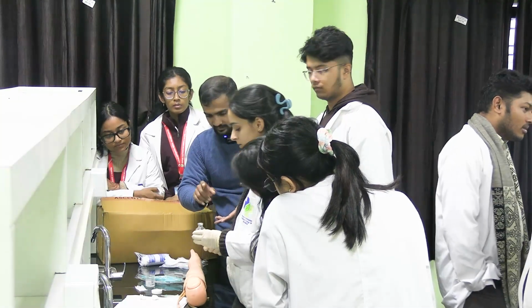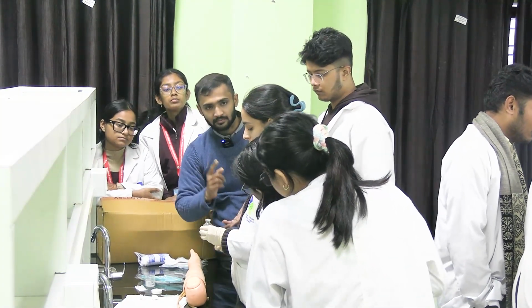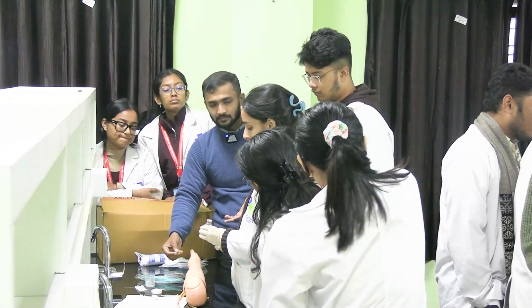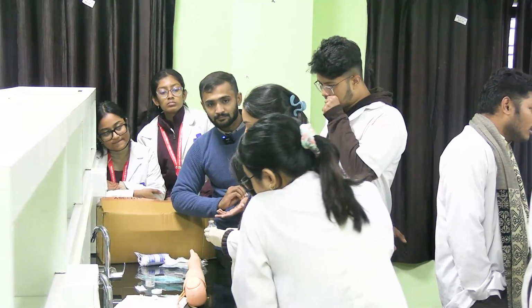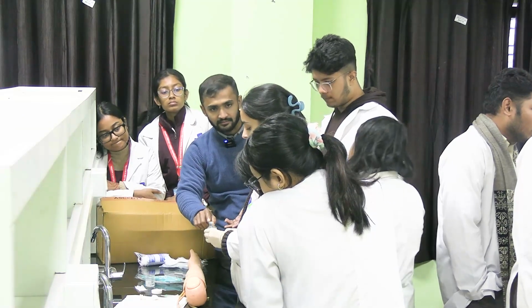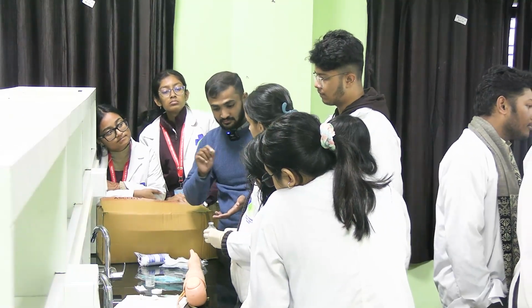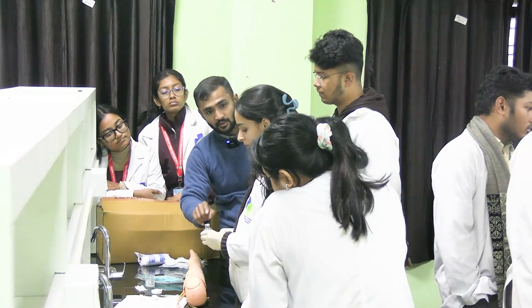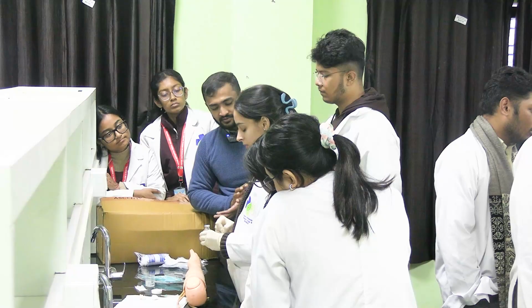In this vial, actually, it has first a plastic cover. Below that there is a rubber cover. So you have to remove the plastic cover, and don't touch it. After removing the plastic cover, this rubber cover will be there. Here you have to sterilize, disinfect the area again, in the same way, circular motion.